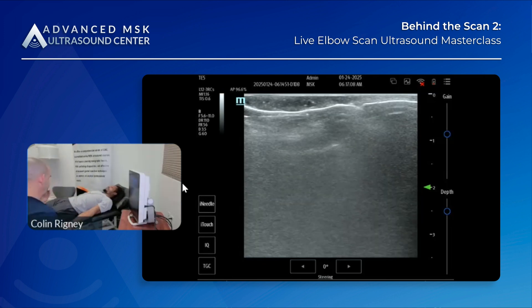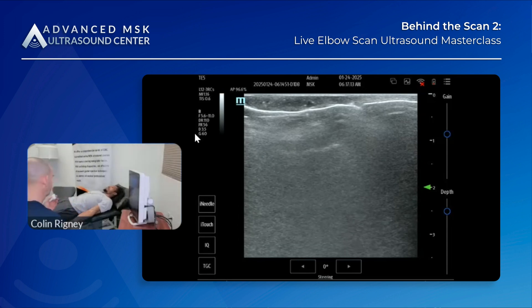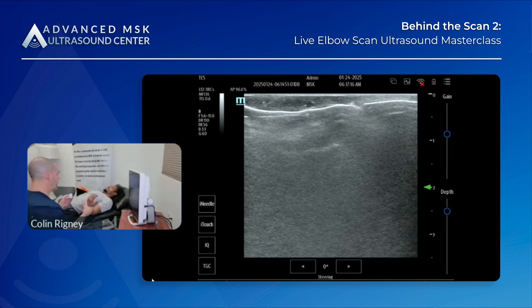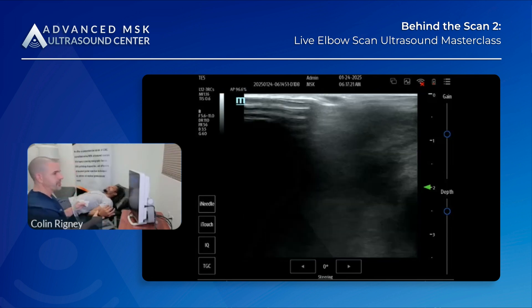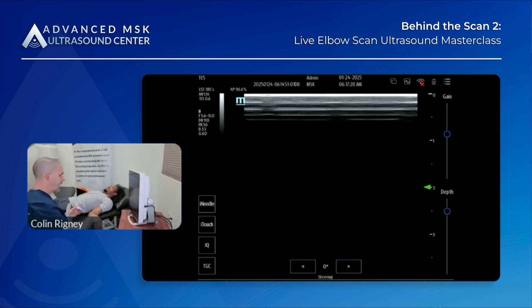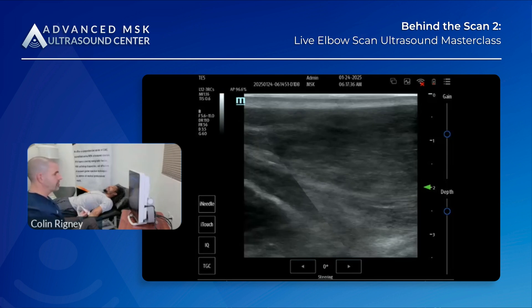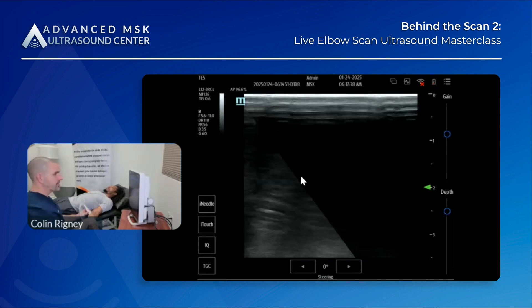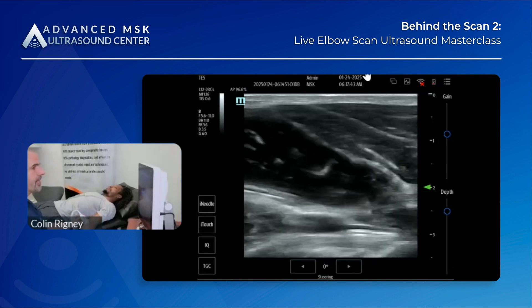Now let's go to the medial window and compare and contrast the dynamic element. If you look in the textbooks you'll see the medial window with the patient position like this. I agree with Ryan that it's a little easier, and especially if they're symptomatic I can get them here and let them rest. The muscle group I'm using as the acoustic window to visualize it is the pronator teres — the medial window, aka the pronator window.